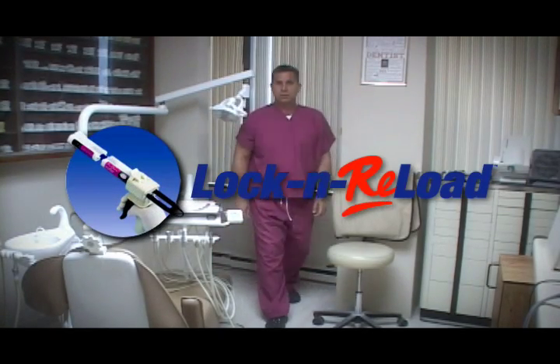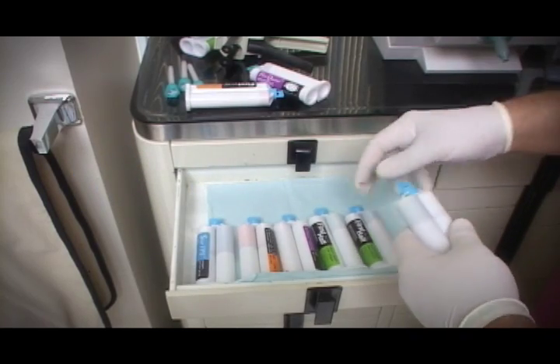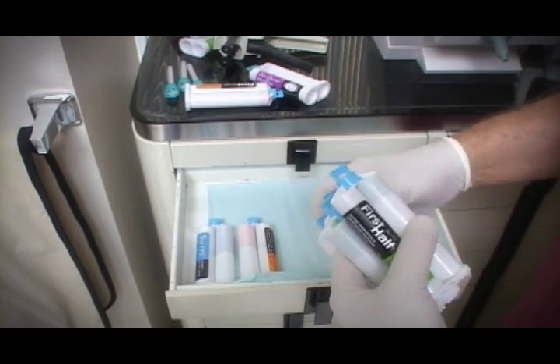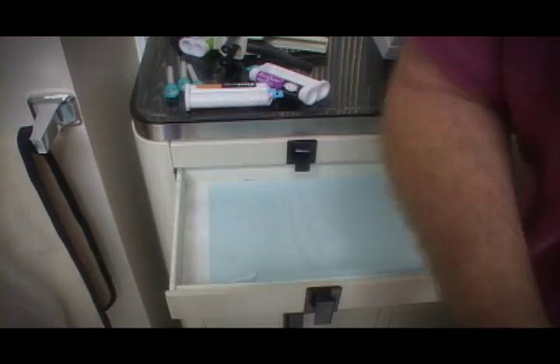The Lock and Reload. We all have the same problem: dozens of used polyvinyl VPS impression cartridges with usable material left in the tube, but not enough to make another impression. It's a waste of time and money.